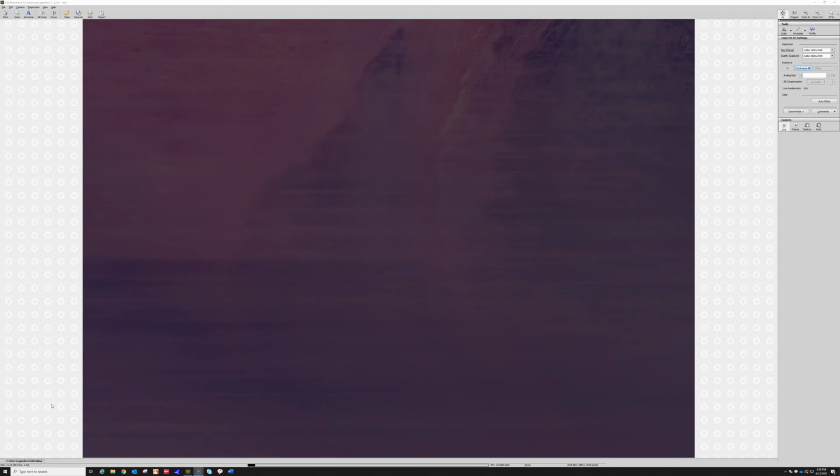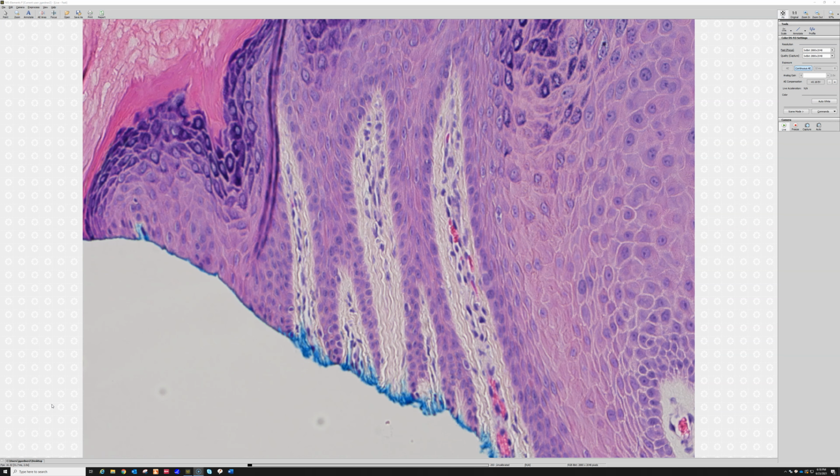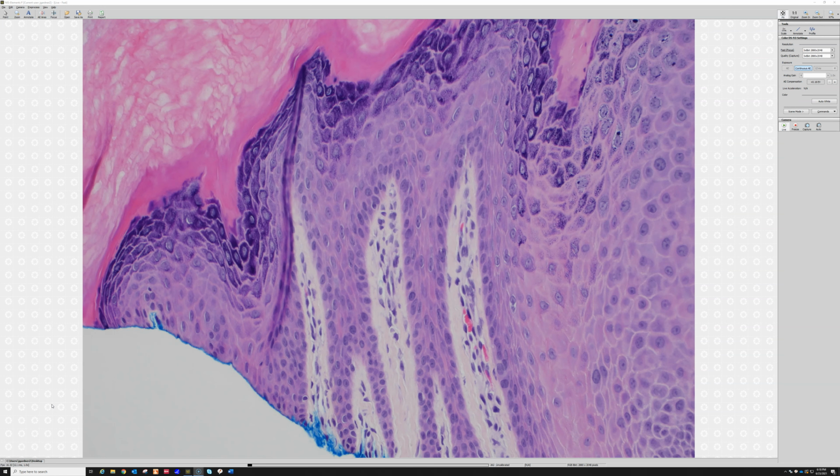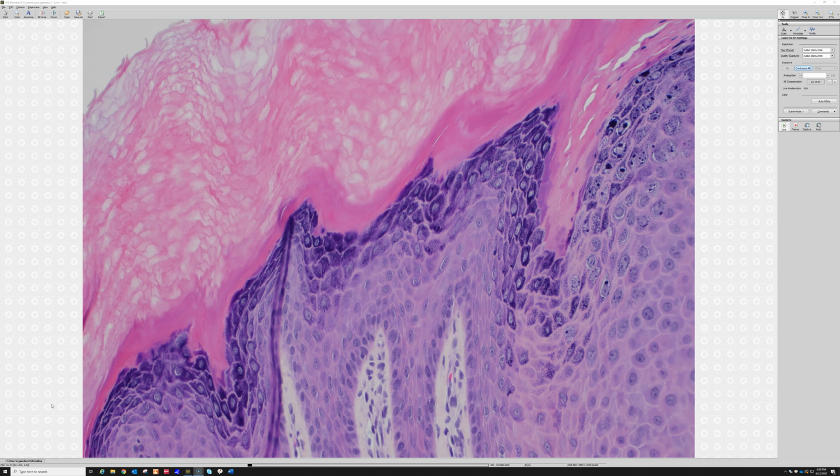Yeah, here we go. You can see there's the basal keratinocytes. And as we go to the top, the nuclei are actually starting to get smaller as we go up here, okay? Little tiny guys. They sometimes have that little halo. Again, that is an artifact of processing. The tissue shrinks and it pulls away from the nucleus.